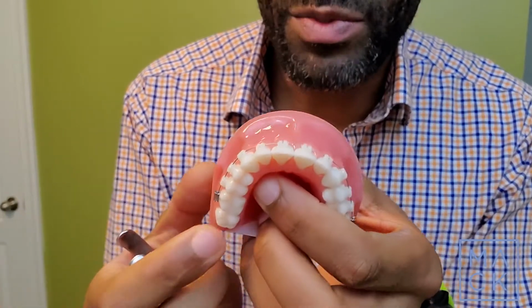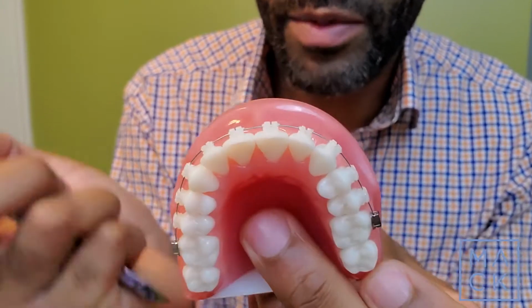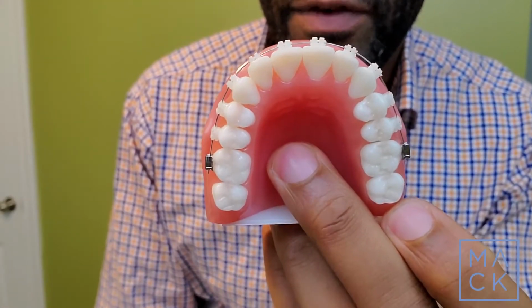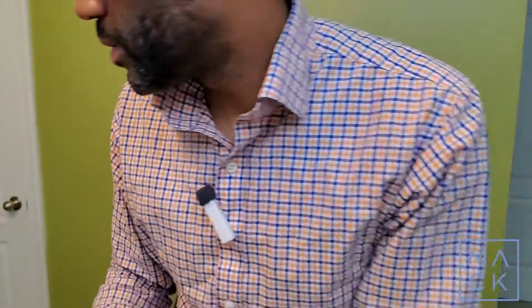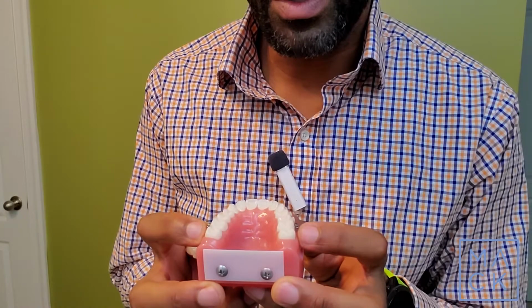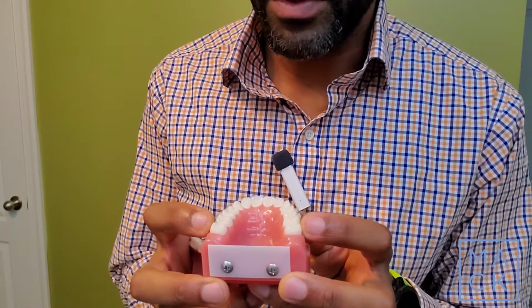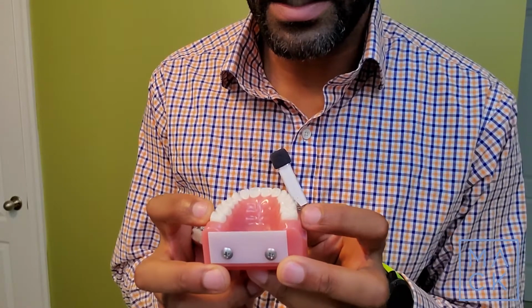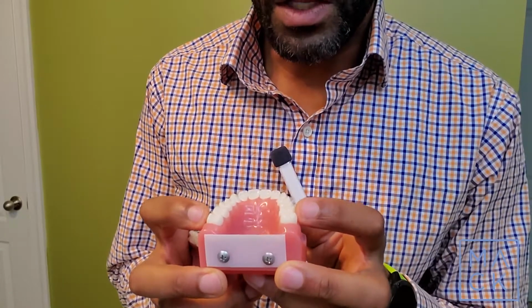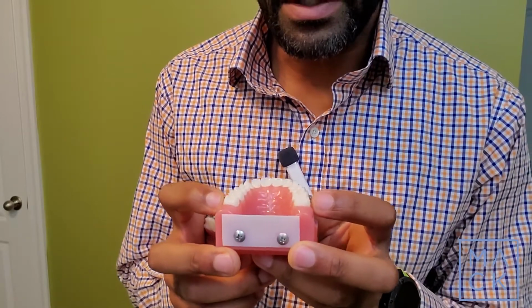That's the time when the wire is most likely to be sliding around in your mouth, but that's also a time that's pretty easy for you to slide the wire back if you've got one side that's poking or bothering you. Another thing you can do when you have wires that are just a little bit long on both sides is use wax to cover those ends. I'll put a link to that video in this video, to show you how to use wax.